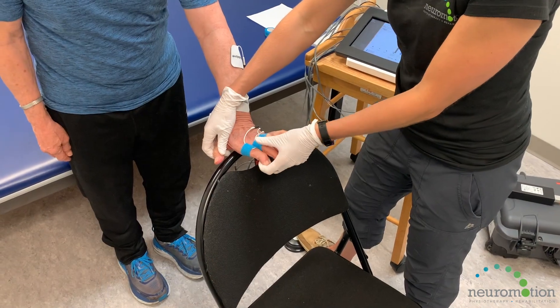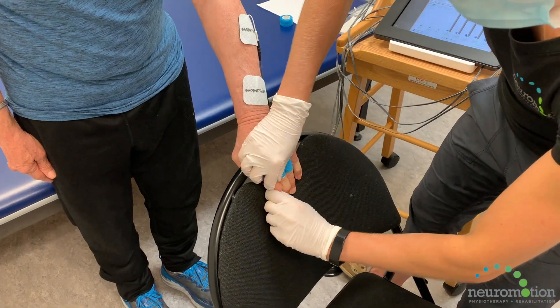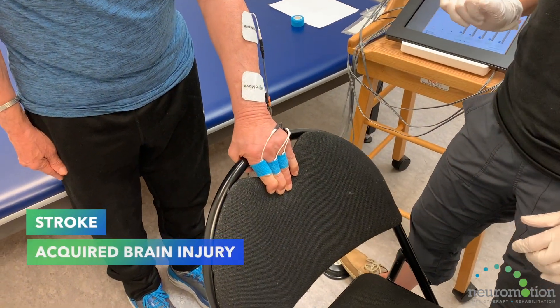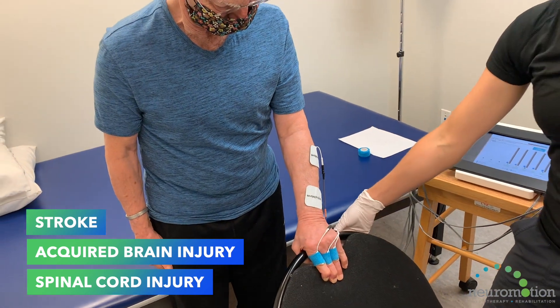It performs certain protocols including forward reach, side reach, and also works into grasp. Clients appropriate for the Mindmove device would be someone who has experienced a stroke, acquired brain injury, or a spinal cord injury — where they're having some weakness or paralysis in one or both arms, as you can do bilateral as well.